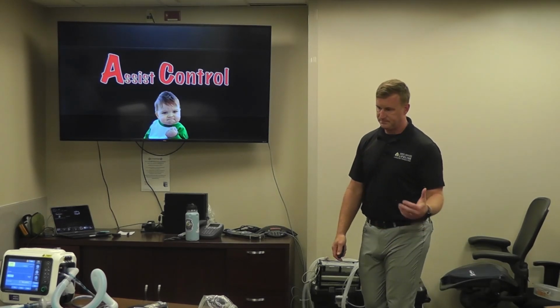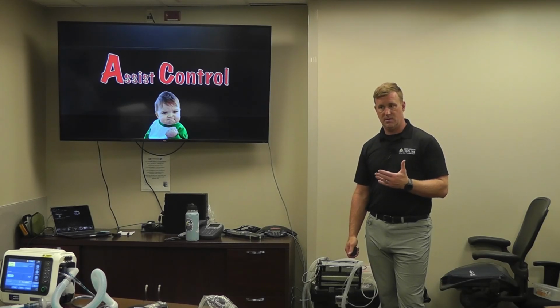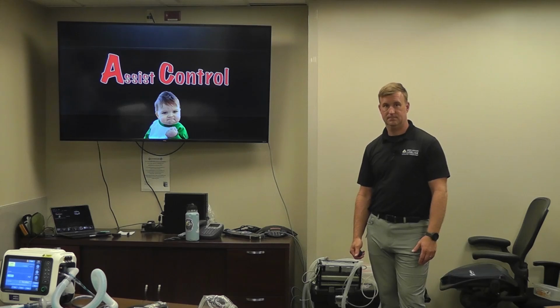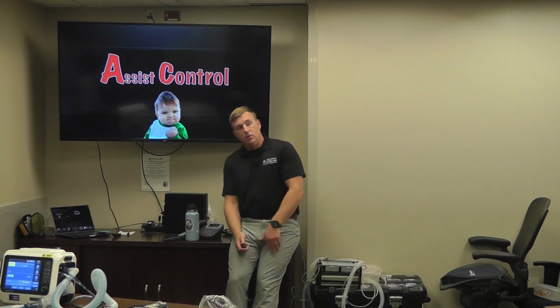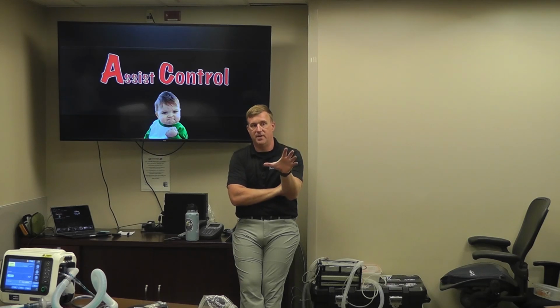So, assist control, or AC. Anybody know what the difference between AC and SIMV is? Anybody have an understanding of this? Just control is every breath is a controlled breath by the vent. So if the patient triggers it, it's going to go to the programmed breath. SIMV is when the patient triggers a breath, there's a pressure support of that breath, but it's not going to be a full programmed breath. To some extent, yes. Your AC, perfect. SIMV is a little bit different, and we'll talk about that here in a second.